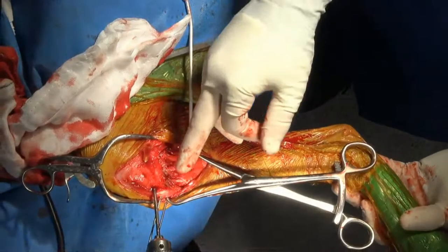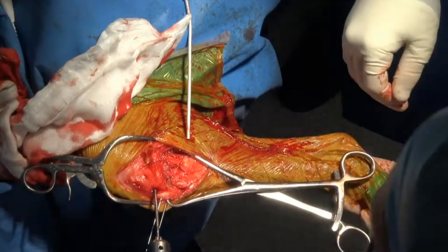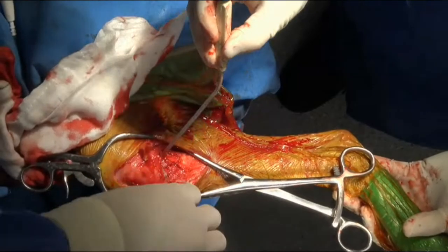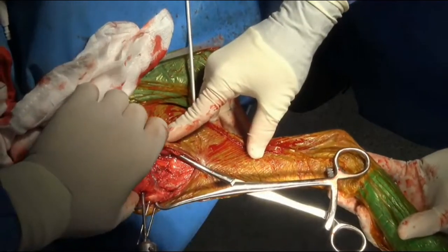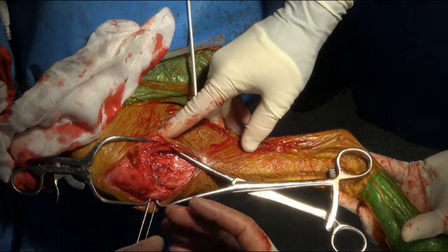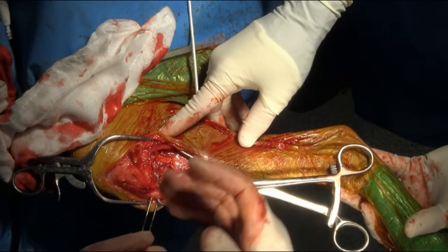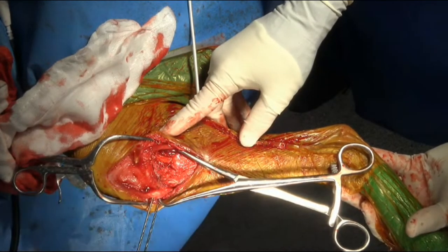These pins, you need to try and be perpendicular to the cut, or does it not matter too much? It's not absolutely critical. So everyone's just asking, with the headless compression screw, we're going to generate some compression. Does the screw need to be perpendicular to the osteotomy? It's not absolutely critical for this. We shouldn't get too much movement because it's going to be pulling on a slightly different angle. Yeah. I'm actually pretty happy with that. It's on a bit of an angle like this, but I think as it pulls in and compresses, if anything, it's going to pull that caudal aspect of the bone up and maybe compress a little bit more.